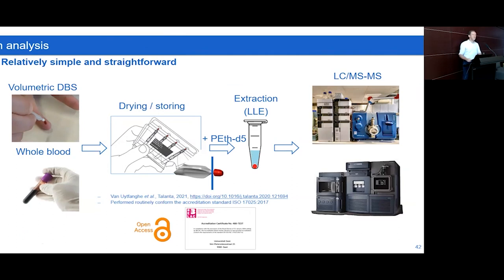We participate in proficiency tests and so on. Certainly the supplementary information is actually quite relevant, because we dealt with quite some issues. We also compared with another lab in order to get to comparable results, and everything is detailed in this paper and its supplementary information.